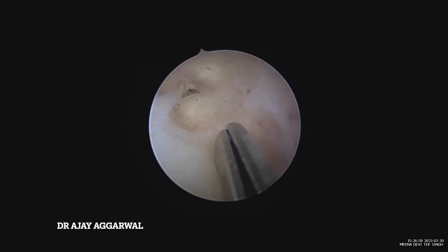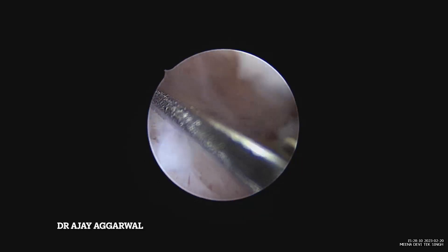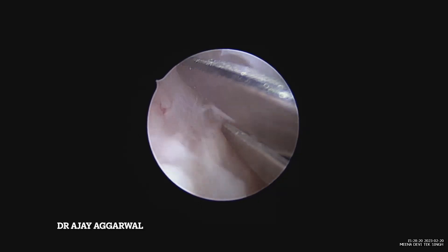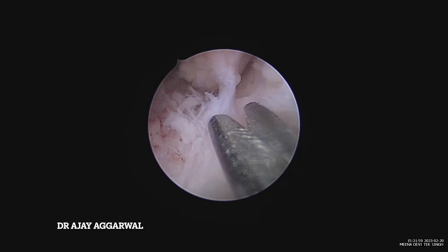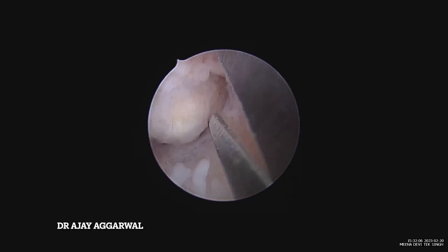I am excising the tissue, separating it from the normal underlying tissue, and cutting. The entire caseous tissue is going up into the cavity and the underlying normal tissue looks fine. Gradually, with small cuts, the entire tissue is excised. Once excised, we remove it with the help of a grasper, or you can do a gentle curettage. Since the endometrium is already lost in this case, we really don't want to be very vigorous — I don't want to lose any remaining endometrium.